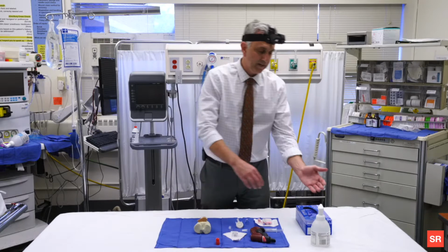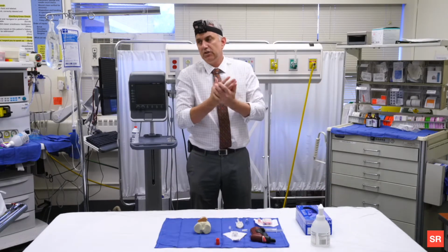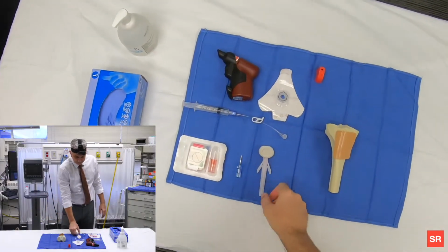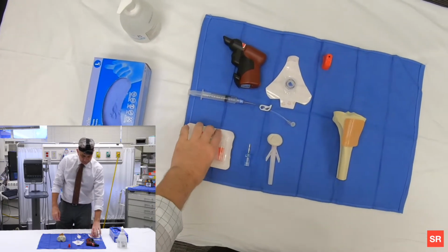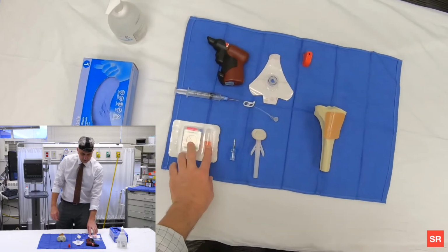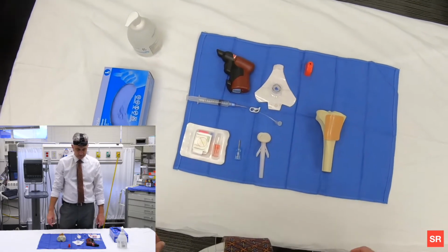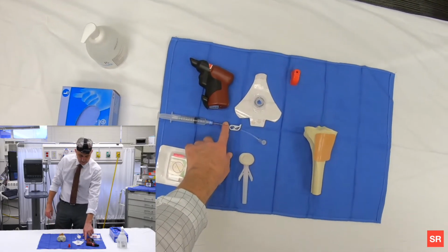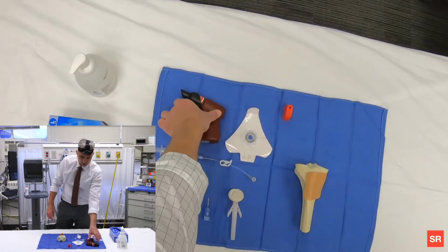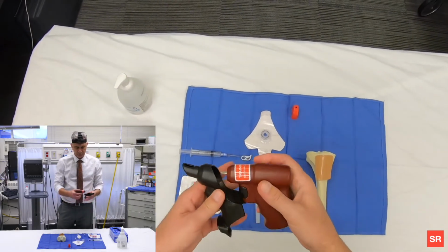I'm then going to wash my hands and gather my supplies. So I'm going to need a ChloraPrep and a 15 millimeter intraosseous introducer needle for a pediatric patient. Today I'm going to be demonstrating using the adult 25 introducer and the adult bone just for demonstration purposes. I'm going to need a flushed IV pigtail, a dressing, and the introducer drill. And it's good at this point to check to make sure the drill is working. Great.